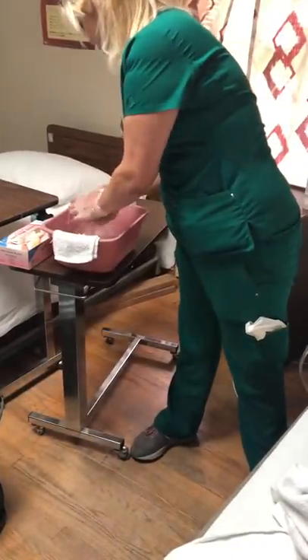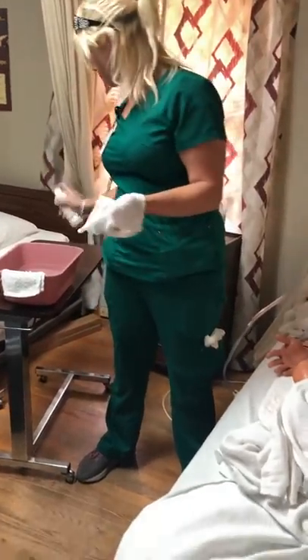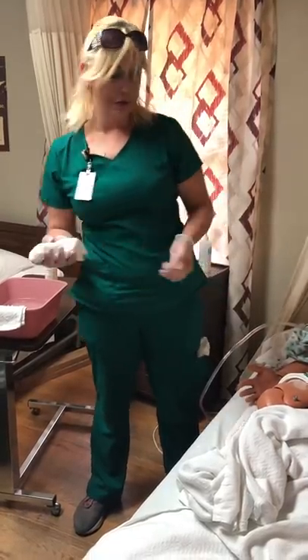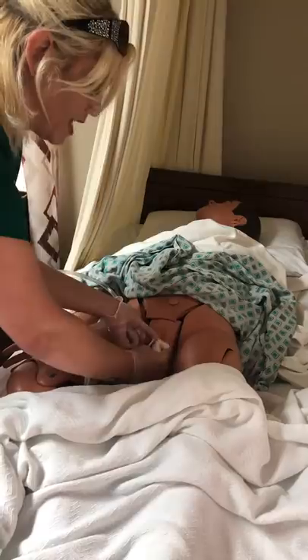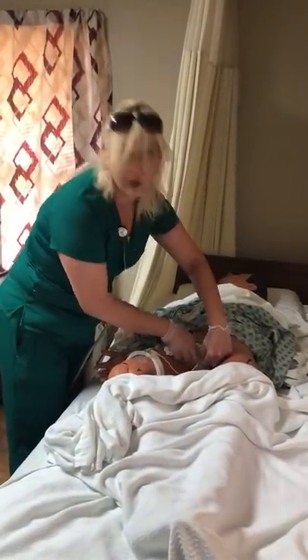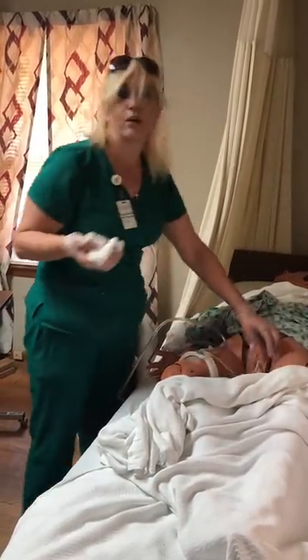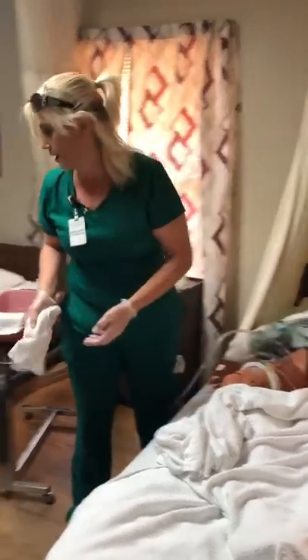I'm going to take my first washcloth and add some soap. You have to make sure that you're using a different spot on the washcloth for each wipe, so what I like to do is fold it in quarters. Make sure you're holding close to the urethra and wipe clean like a clock face — 12 to 6, down. Flip it over to the clean side of the washcloth and do 12 to 6 around the catheter insertion site again. Then fold it completely in half and wipe down about three to four inches, flip to the other side, wipe down three to four inches, then this can go into my dirty linens.